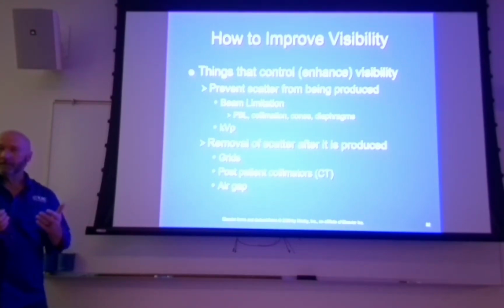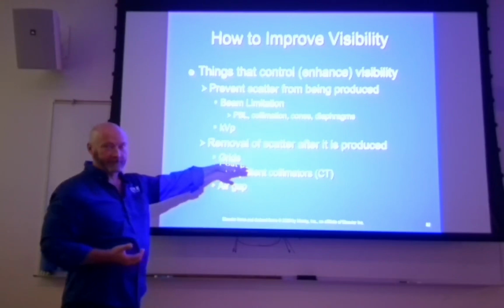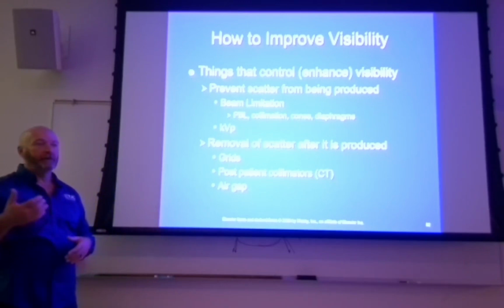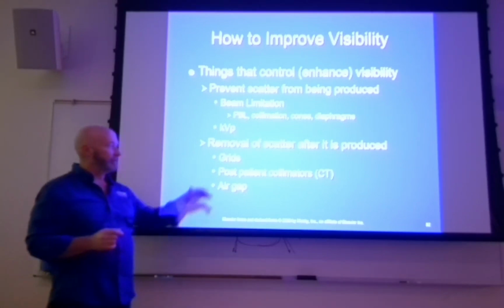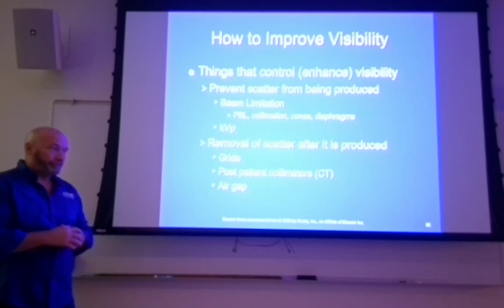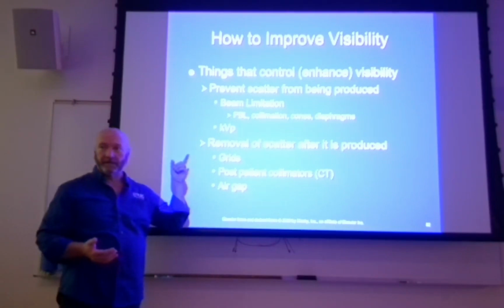A little bit? Yeah. Okay. So they're effective, and they're probably more effective than the air gap, probably not as effective as physical grids. I think they'll probably dial that in a little bit better over time, and they'll become more effective. The benefit of a digital grid versus a regular grid is in patient exposure. If you're taking an X-ray on a thin patient's abdomen, let's say a pediatric abdomen, probably better to go with a virtual grid than a traditional grid.